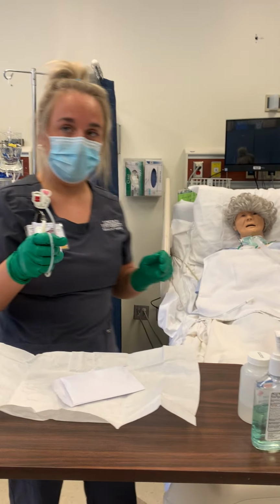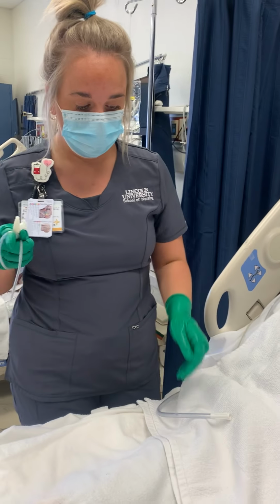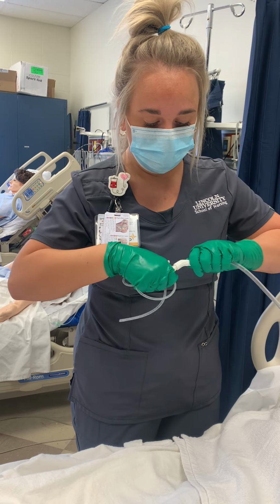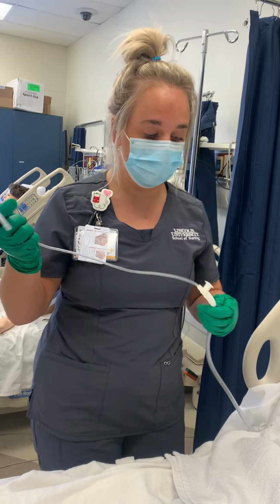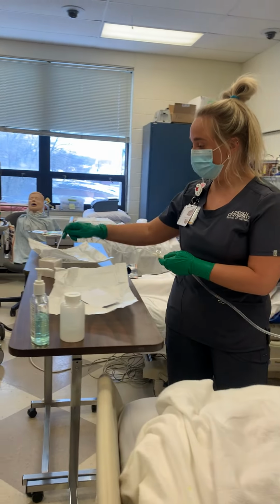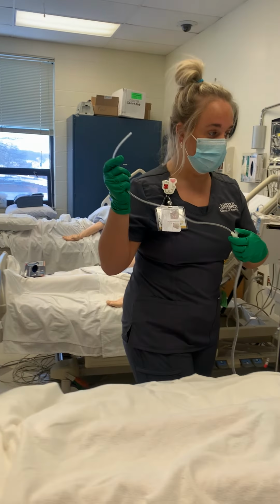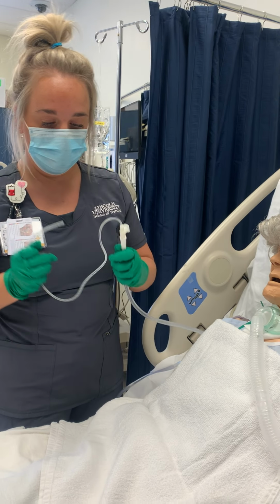All right, so I'm gonna come over here. I'm gonna break sterility with my non-dominant hand. Okay. I just gain control of it. And I'm going to work first by flushing the line. Okay. With my non-sterile hand again, I'm going to remove her oxygen.